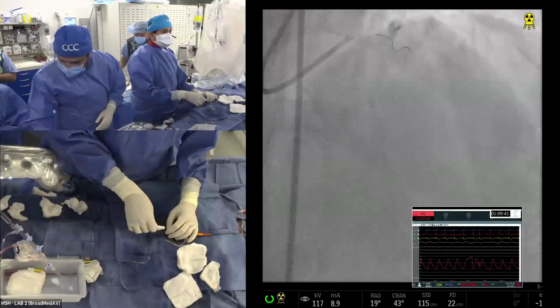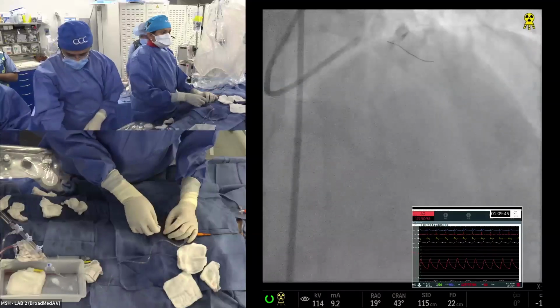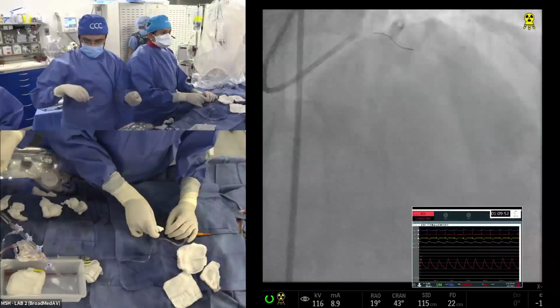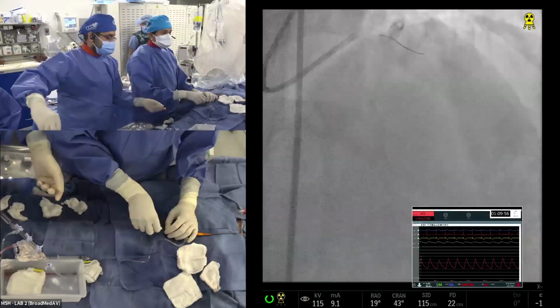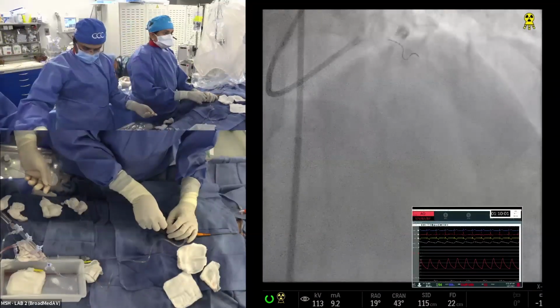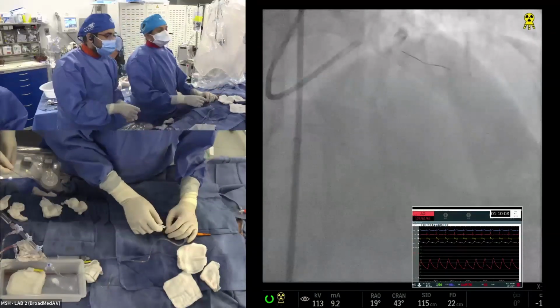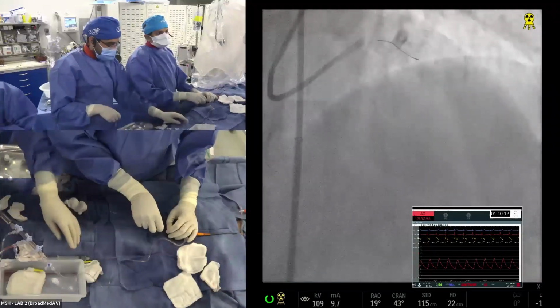We used a 3.25 cutting balloon at 12, 14 atmospheres after rota, and it was fine. Dr. Sharma, is it okay to go with a guide plus or something to have a burr into the diagonal and then take it so that you are preserving the wire in the LAD? Yeah, that's a good point. But remember, to have that, you need an 8 French guide almost. Yeah, 8 French guide. I know that strategy has been written, but we have never used it, because in our opinion, it was never needed.